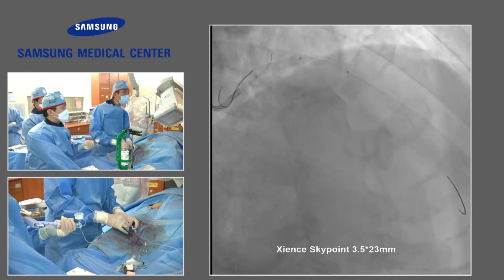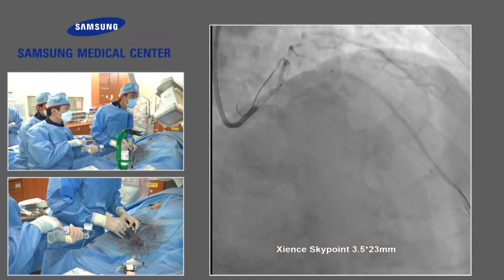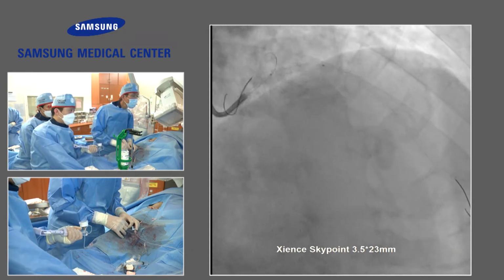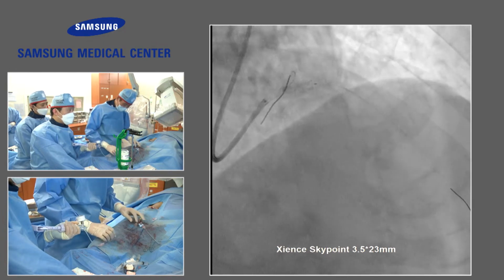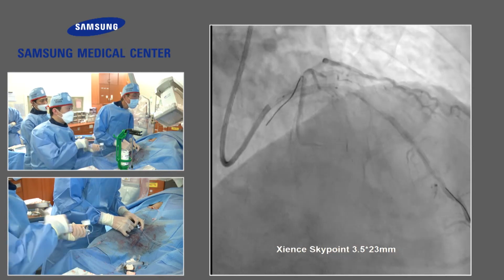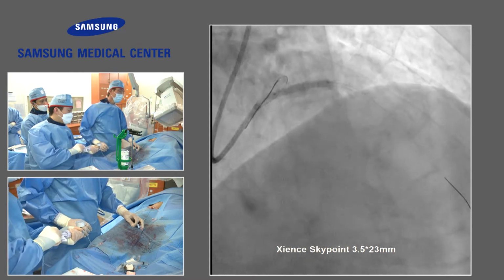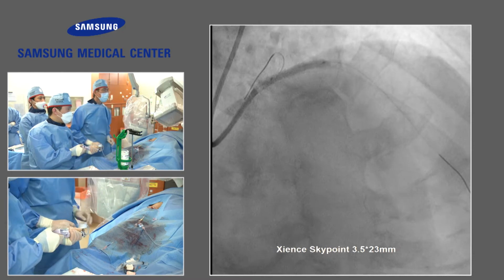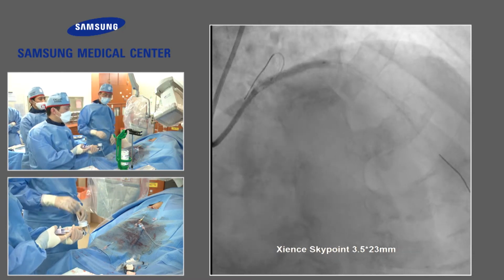And I like to post-dilate, test. Post-dilate here, test. Maybe without wire is kind of dangerous, but the EBC recommended post-dilation test. Okay, here, inflation. 14, 16. Okay. There's some under-expansion in the distal part. Deflation. Inflation.